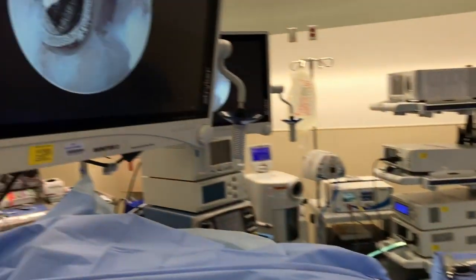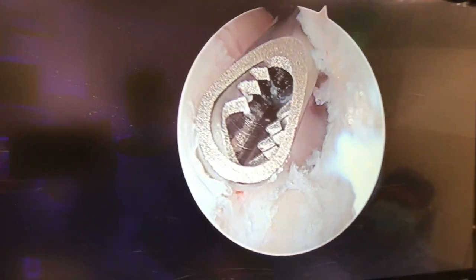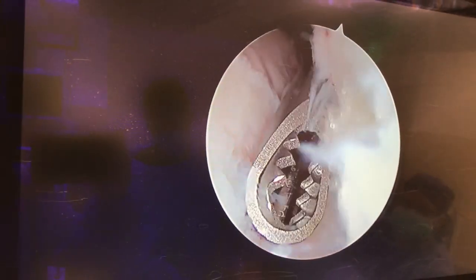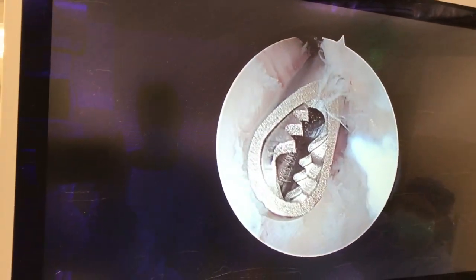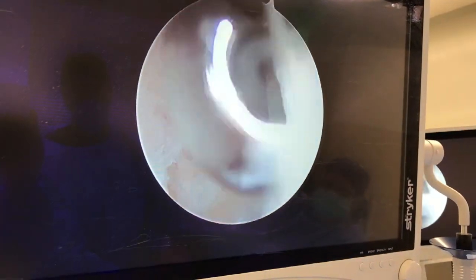If you look down here at the screen, you'll see the teeth right here, and of course the suction goes through. If I turn it on, you'll see the soft tissue suck inwards. And then to get the tissue out, you put on the reciprocator and then clean up the area.